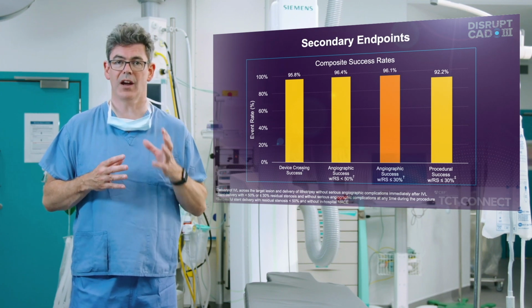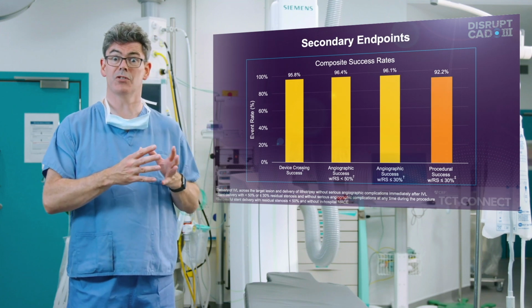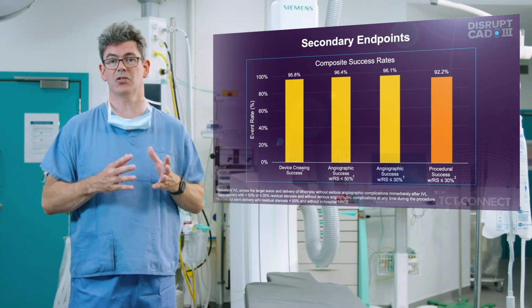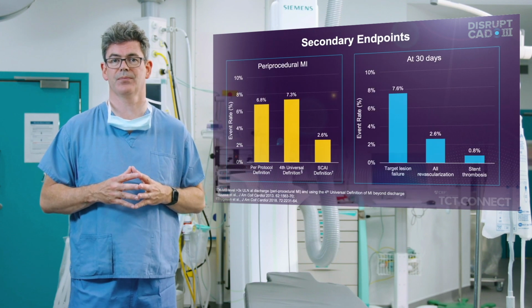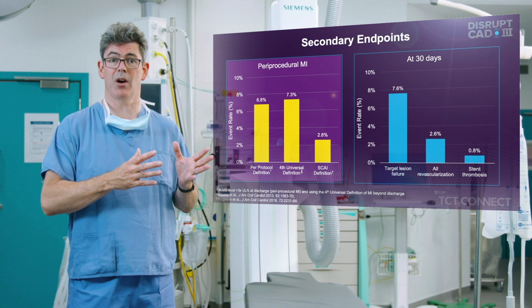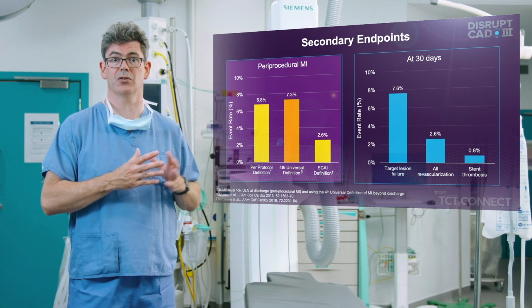All of these were 96% or greater. Procedural success with residual stenosis less than or equal to 30% was 92.2%.